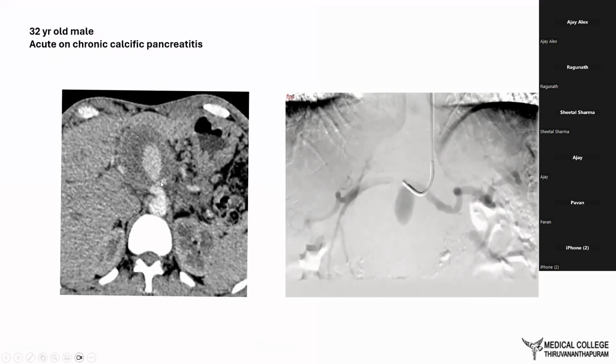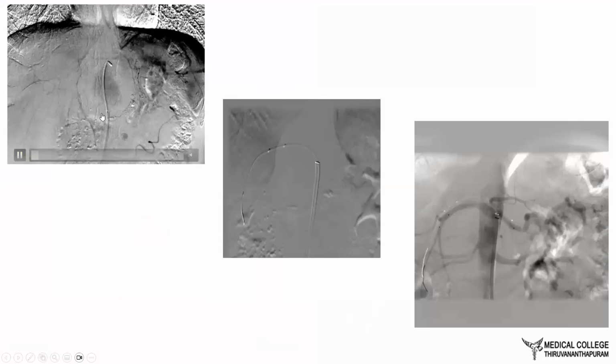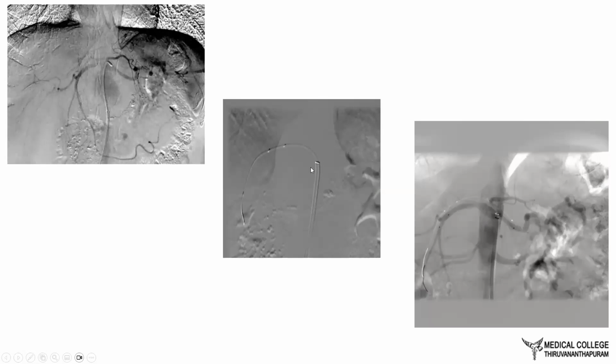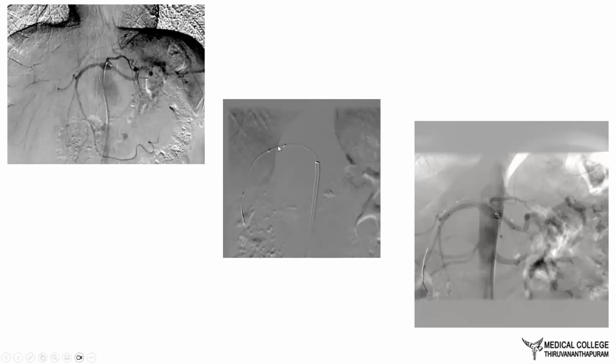So the treatment issue was because this was right at the junction. Any coiling at this part would entail that the coil may prolapse into the hepatic artery or branches of the celiac trunk, occluding it. So initially we tried through the femoral route. We passed a long sheath into the celiac level from the aorta. We passed a 0.014 wire with a coronary balloon. This was a 5 mm Medtronic coronary balloon, I think 15 mm length, initially passed through the femoral route.